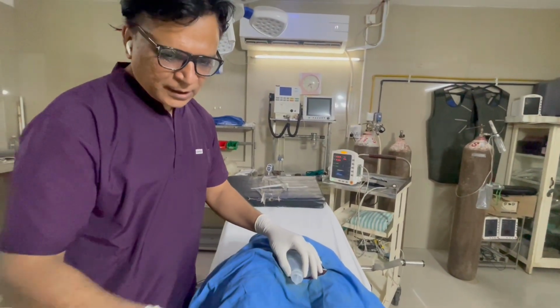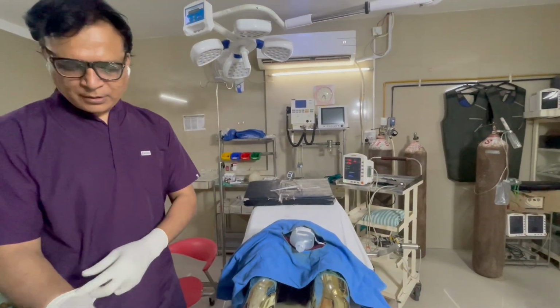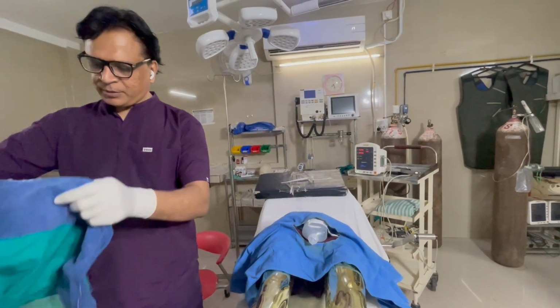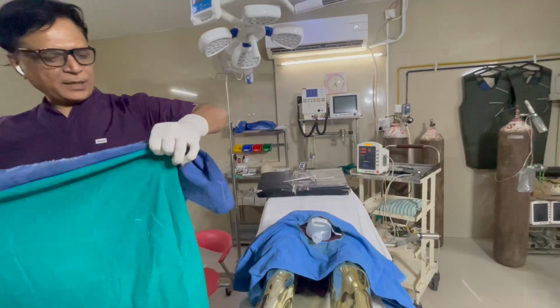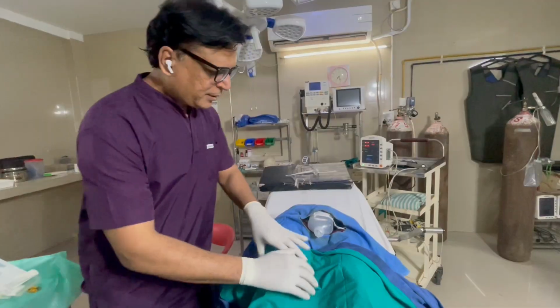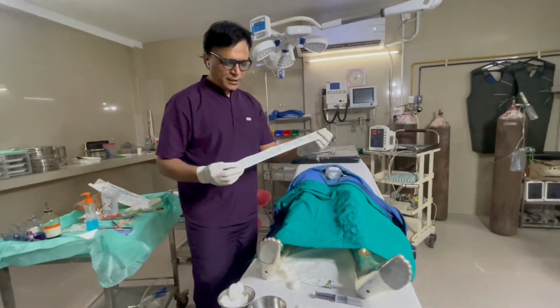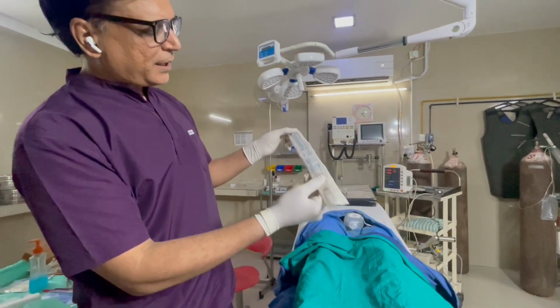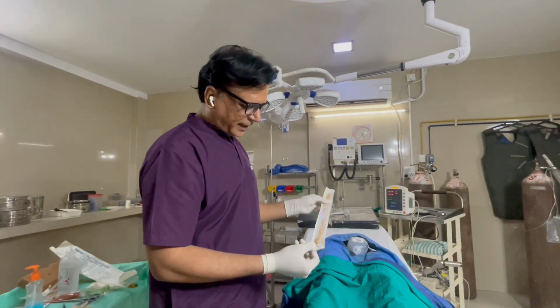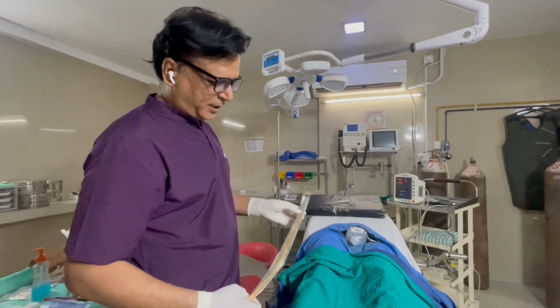So once the penis and the tip, prepuce, everything is clean, I will change my gloves and put a sterile drape and cover all the part where I am going to do the catheterization. So I put a drape, then I collect the items. So this is the Foley's catheter. I will check the expiry date. It's around 29 December, and see the number of the catheter. Looking at the markings, I should be able to judge it is a 14 number catheter.